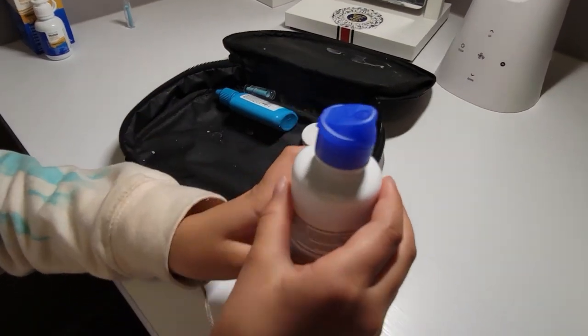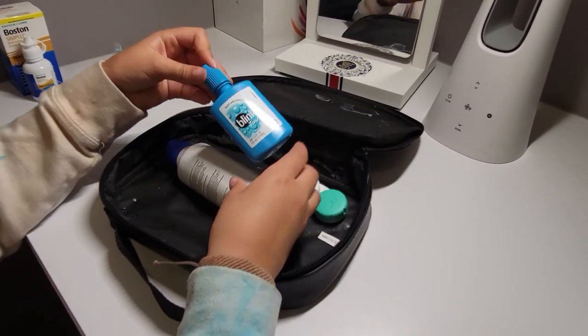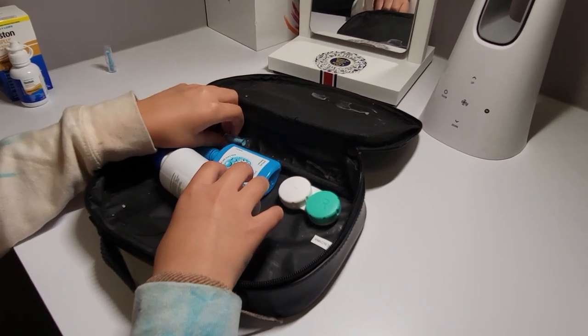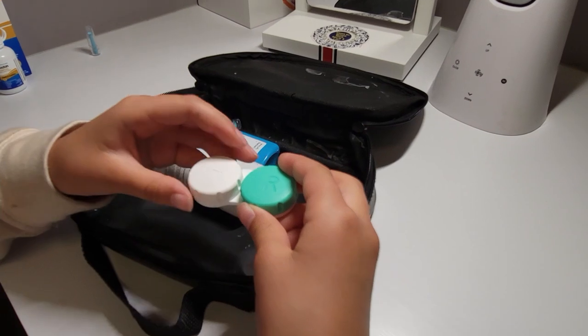This is my solution, and my drops before I put my contacts in. And then this is to get my contacts out. And these are my contacts in my contact case.